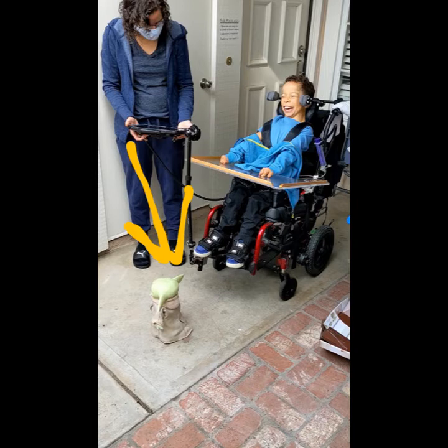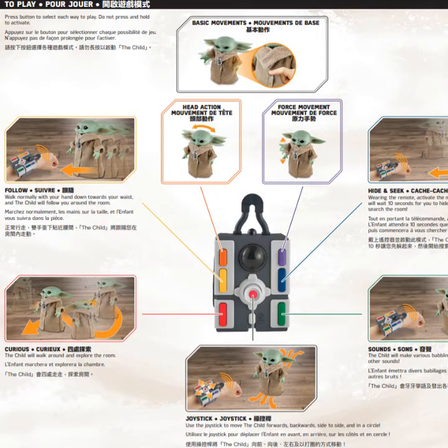What kid wouldn't be excited to play with a remote controlled Baby Yoda? So a big thank you goes out to Mattel for creating this awesome toy that comes with an infrared remote control. Now Tyler has a way to play with a toy that any other kid his age gets to play with. Wait until you see the look on his face.